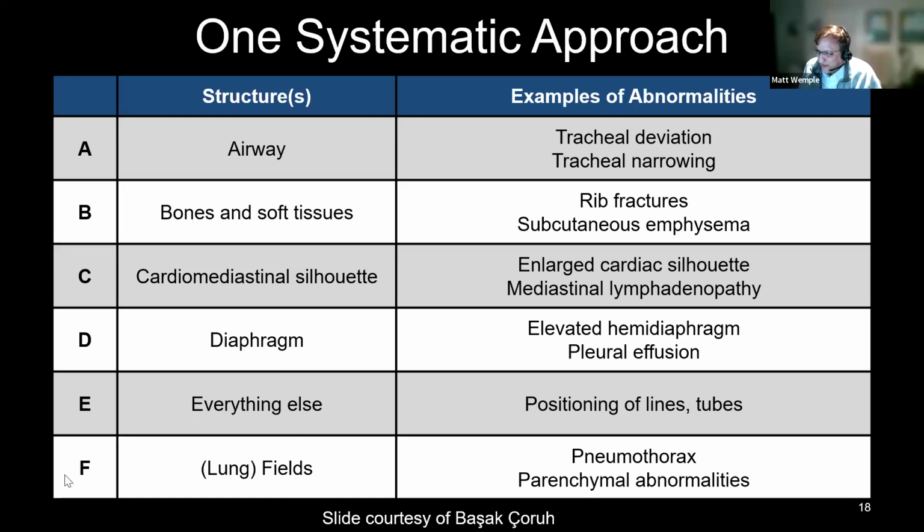In the ICU, a lot of times the attendings will ask you to comment on the positioning of the lines and tubes before you go into this A, B, C, D, E, F thing. So it depends. So that's one thing that you might hear.